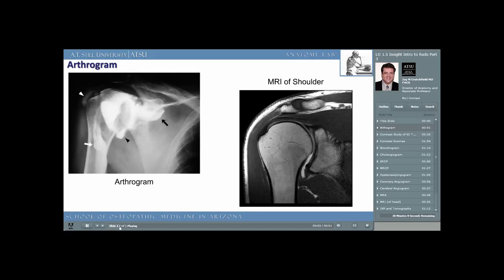Here's an example of an arthrogram. It's almost been replaced today by the MRI scan. An arthrogram can be used on just about any joint of the human body. The radiograph is obtained by inserting a needle directly into the bursa and injecting iodinated contrast — contrast made up of an iodine-containing chemical. It carries the risk of being painful and possibly causing an infection in the joint space. If there is a tear in the joint or bursa, contrast may be seen leaking outside of the joint capsule. The test is most commonly used on the shoulder or knee joint, but it's rarely performed today. MRI imaging of the shoulder and knee has mostly replaced arthrography.